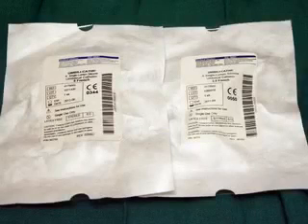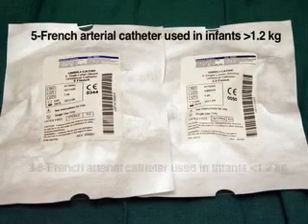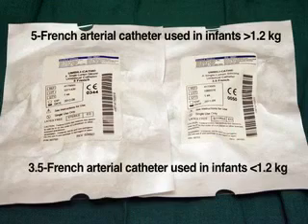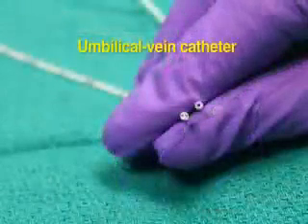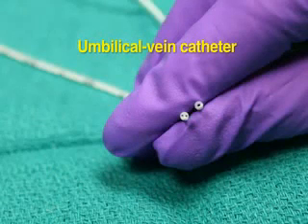There are numerous types of umbilical catheters from which to choose. A 5 French arterial catheter should be used in infants weighing more than 1.2 kilograms. A 3.5 French arterial catheter should be used in infants weighing less than 1.2 kilograms. Arterial catheters should have a single hole and be as non-thrombogenic as possible. The umbilical vein catheter should be 5 French for infants weighing less than 3.5 kilograms and 8 French for infants weighing more than 3.5 kilograms.